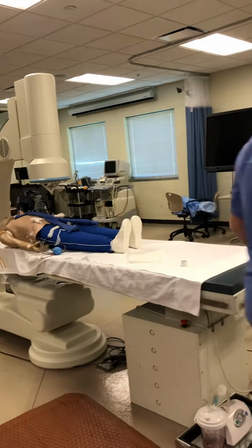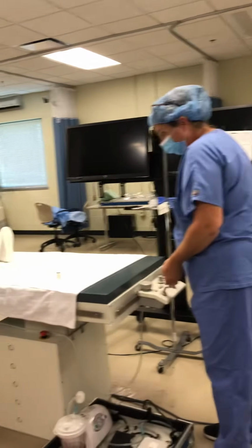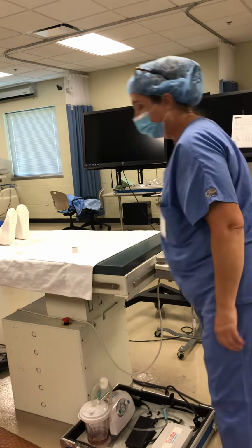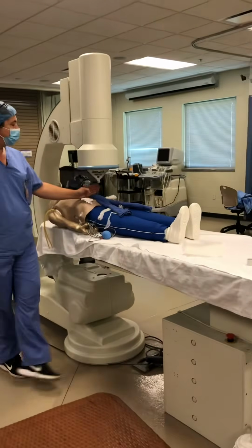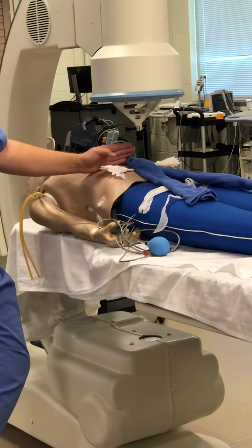So for our abdominal angiogram, remember that our position is going to be in straight AP. So that's pretty simple. Straight AP. And we want our position just above the renals with the center.